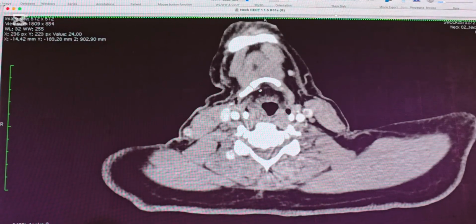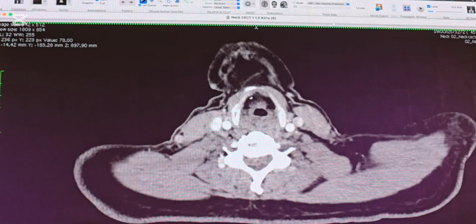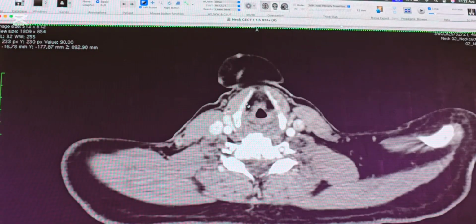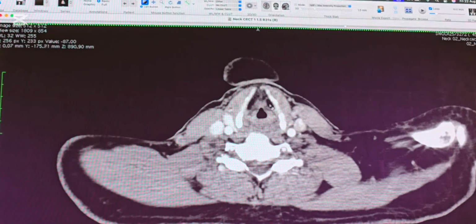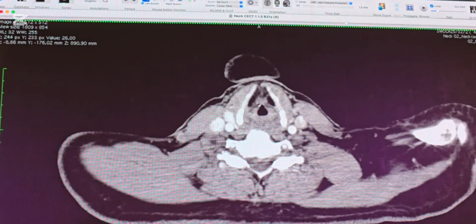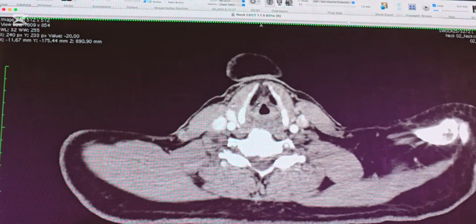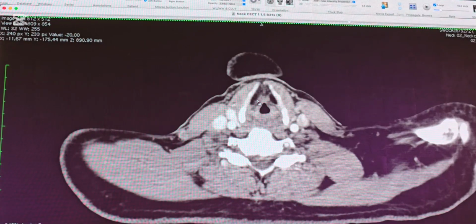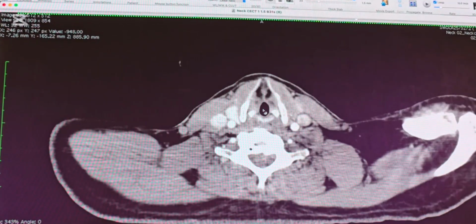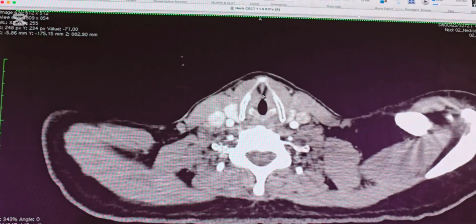So when you just go down, crossing the hyoid, you are seeing the thyroid, superior corner of thyroid and the thyroid lamina. And what is this space? Paraglottic space. All clear? So that's where internal laryngeal, benign tumors of larynx, all those you will be able to see commonly there. And this is still vestibule, and coming lower down, still the paraglottic space are clearly seen.